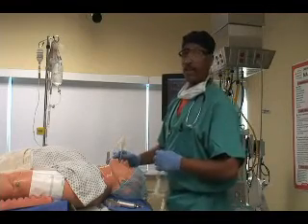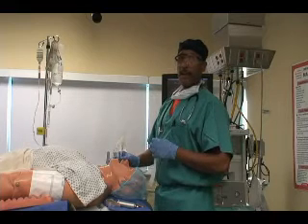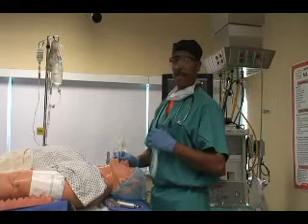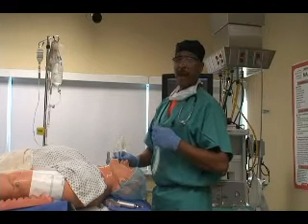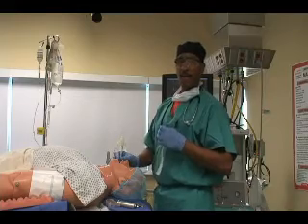So what we've covered in this vignette is direct laryngoscopy: assembling your equipment, assuring the patient is obtunded, opening your patient's mouth, implementing laryngoscopy, obtaining your best view, and insertion of your ET tube.